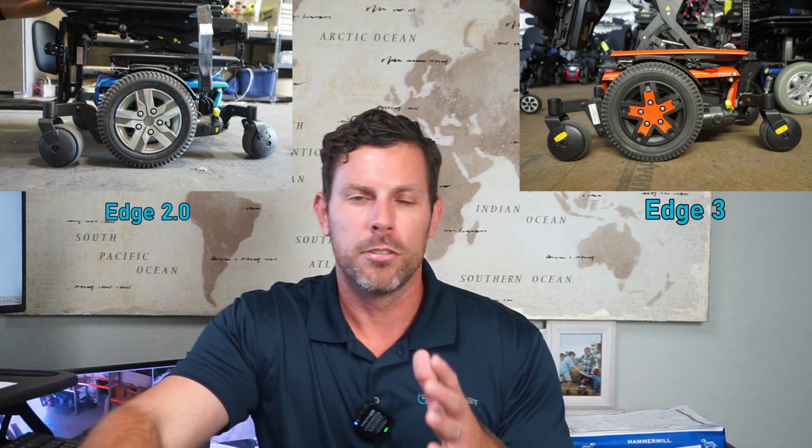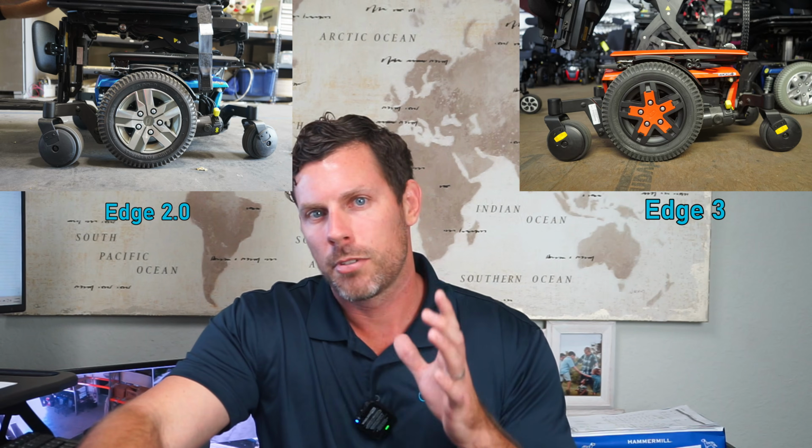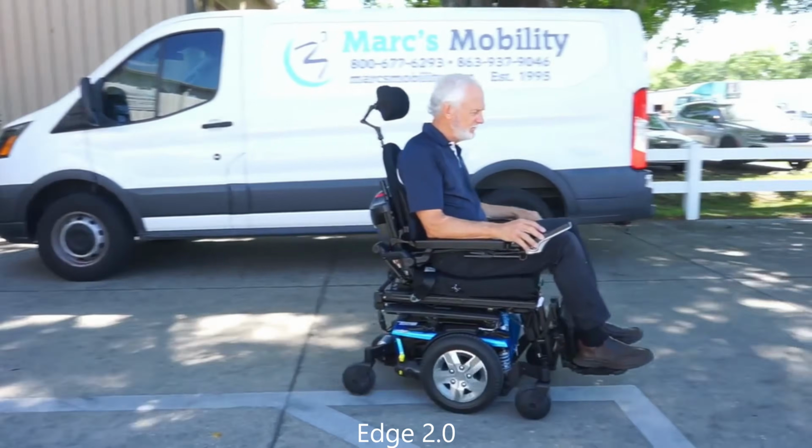So now we're going to break down the mid-wheel drive configuration units. These units are going to consist of a Quantum Edge 2.0, a Quantum Edge 3, the Quantum Stretto, and the Quantum Edge HD. Now I'm going to go ahead and start with the 2.0. The 2.0 and the Edge 3 are going to be similar looking units. If you looked at the two of them as a novice user, you would not notice much difference in these units, but there are going to be some small differences. They're both mid-wheel drive.